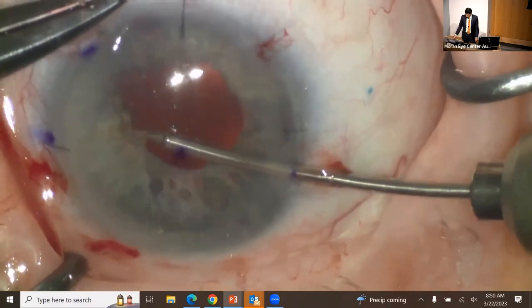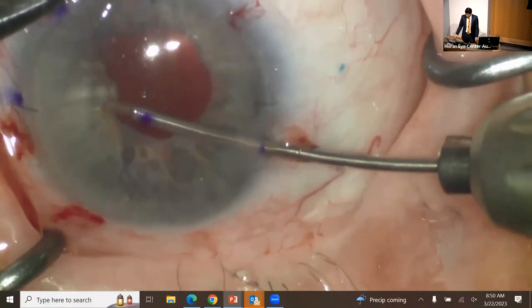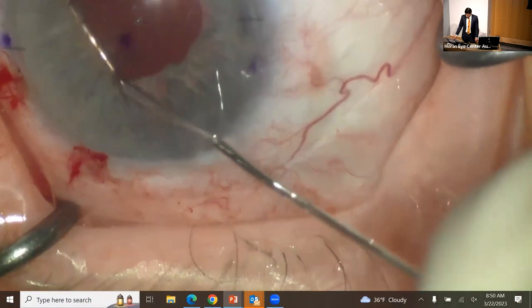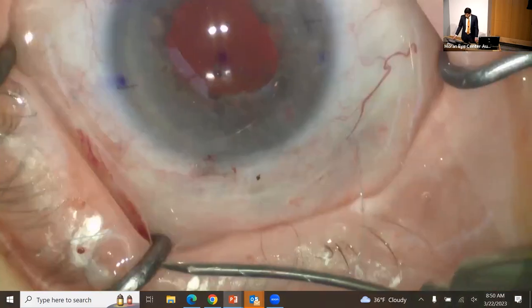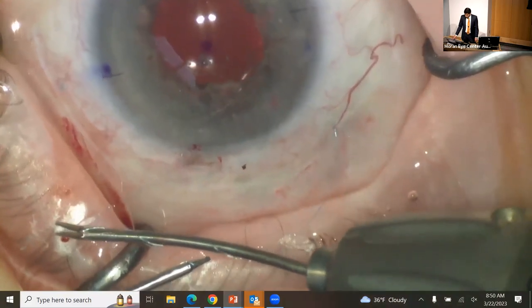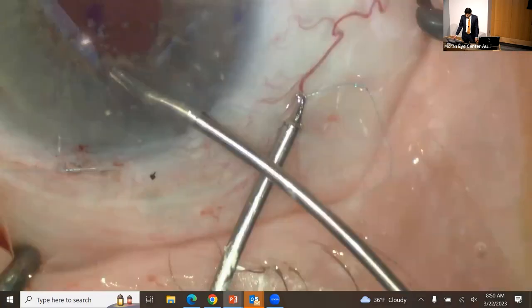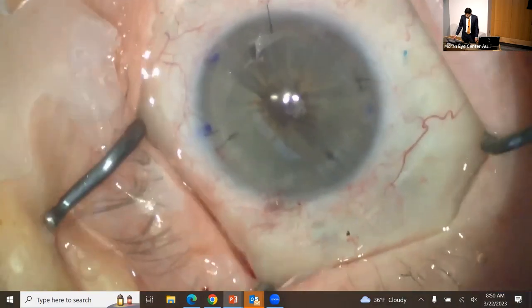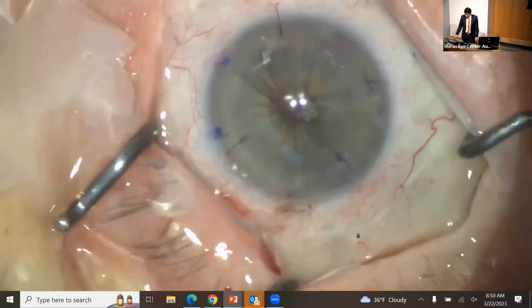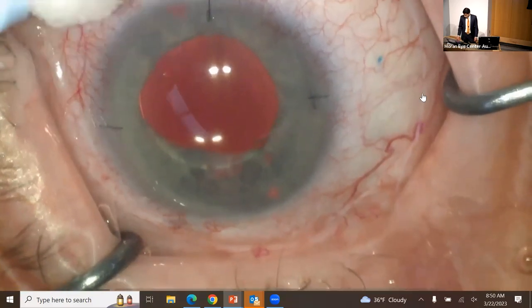Here's Dr. Chamberlain masterfully using the micrograspers to thread the iris over and over and over again around the Prolene on a CIF4 needle. Here the suture knot is being thrown, which is then pulled into the eye. And the patient was left with a round pupil. It was potentially a pupil a little bit on the smaller side, but definitely protective against that lens optic coming forward again after the surgery.